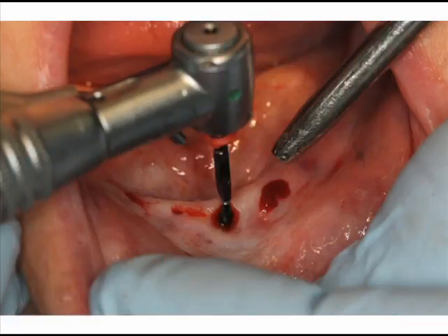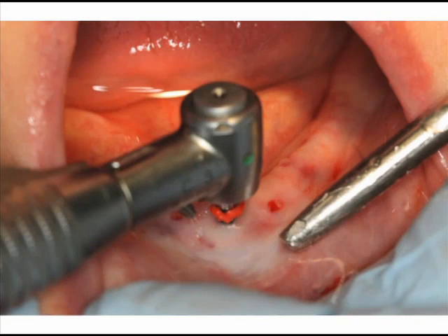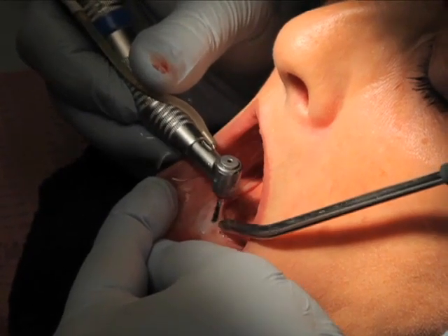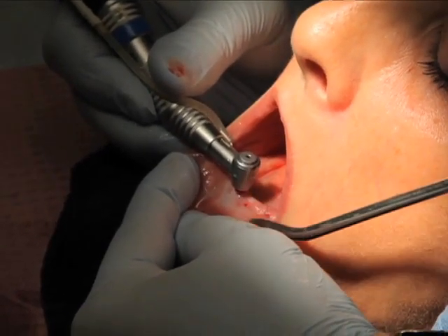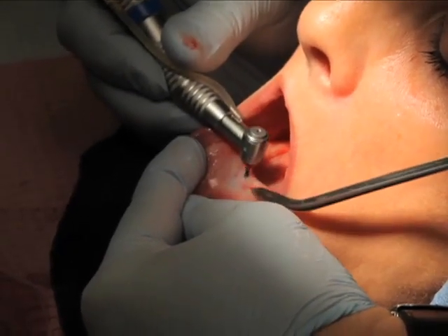The directional guide is removed, and in figure 18, we show a 1.8 millimeter drill used to depth as determined by the analysis of the CT planning software. So the CT planning software allowed us to virtually place the implants prior to any surgical intervention and gave us the length of implant that we want to use. And the surgical guide allowed us to directionally place the implant in the proper position.